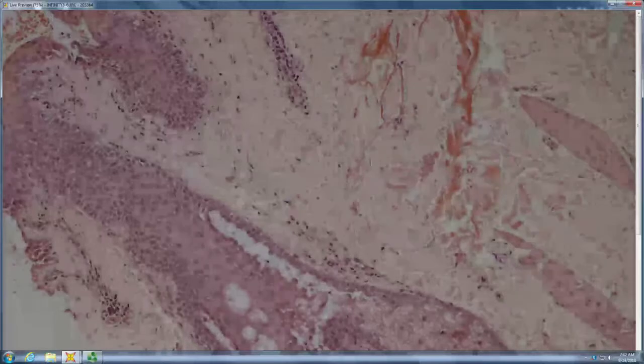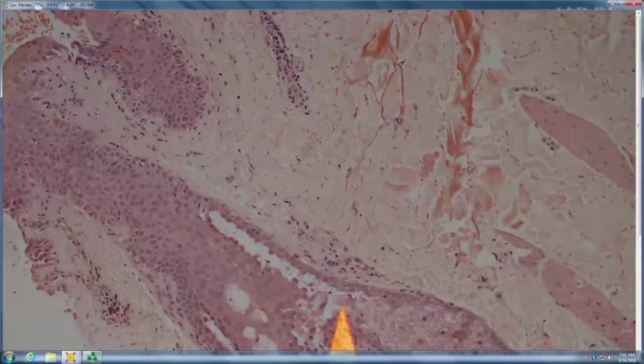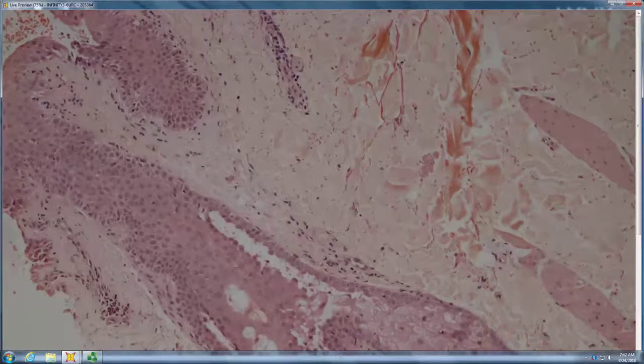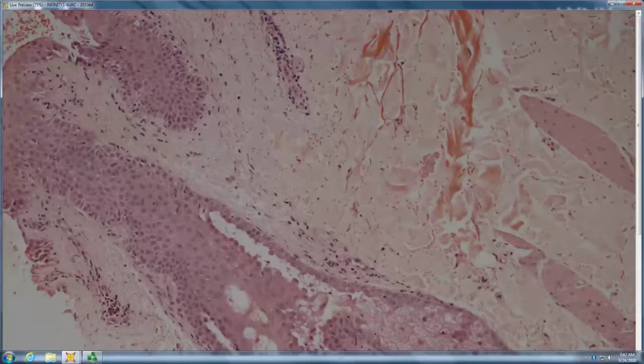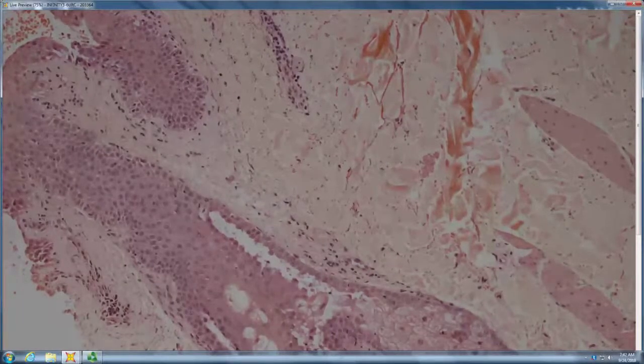Don't see corneum. It looks like an intraepidermal split. I'm not sure if those are dyskeratotic cells. So if you're not sure, do it with and without. What if they're just acantholytic? If they're just acantholytic, then more Hailey. Does Hailey do hair follicles? Not so much, right?